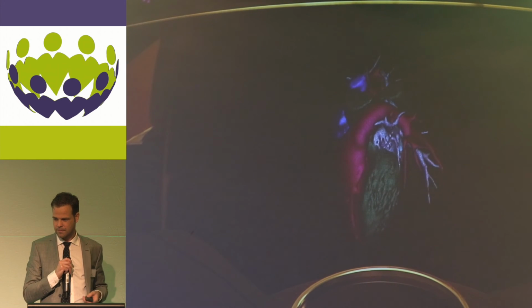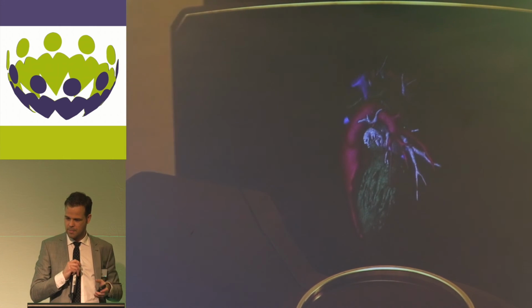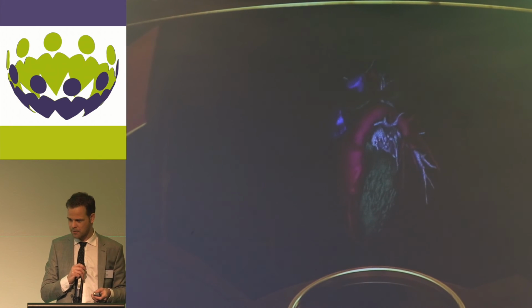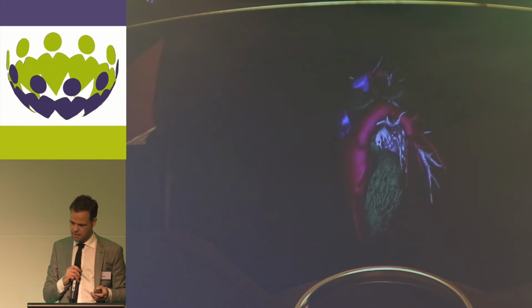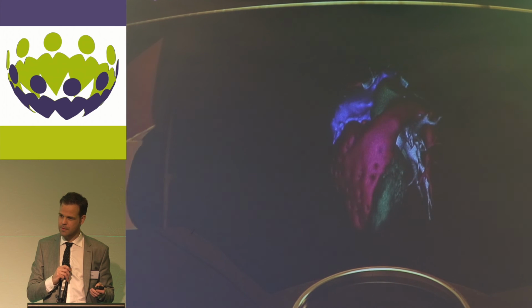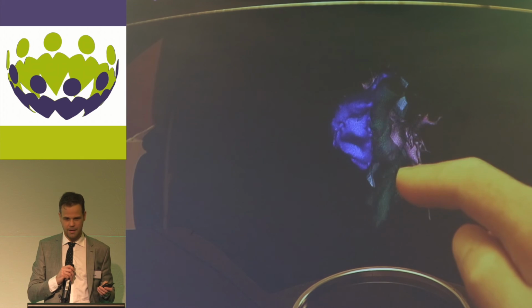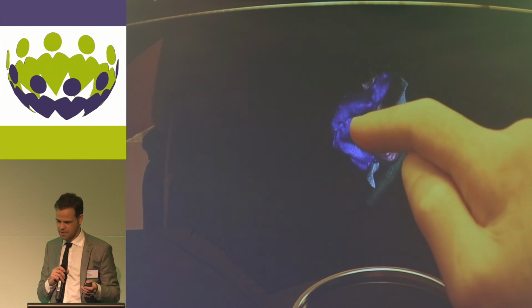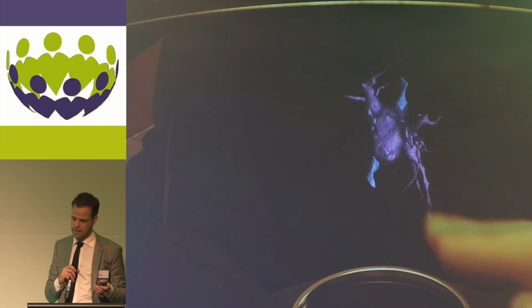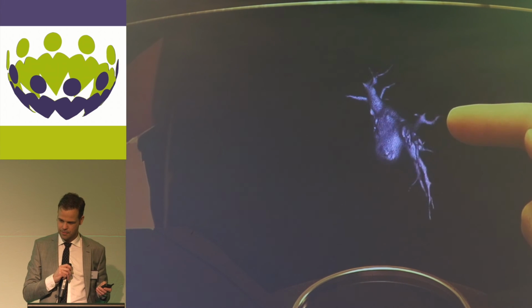And this is just a prototype at the moment from a CT set, I must say, but they're getting a nice idea of the whole anatomy of the heart going around and looking in. And the nice thing is that you can rotate it, but also click on structures to get them away, again like we saw. So only the structures that are relevant we can put in the image, and if we use a specific tool, we can crop into the left atrium in this case. Let's see what we're going to do.